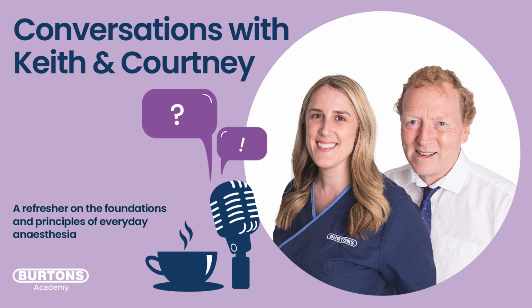We did, yeah. So we've got a patient that needs to be ventilated now, and you're presented with an animal, and you think, okay, I need to ventilate this. So I've got to give it some air. Every breath has got to have a volume delivered to it. That raises some questions, doesn't it? How much, and in what time, and at what frequency? And I think those are some of the first questions.